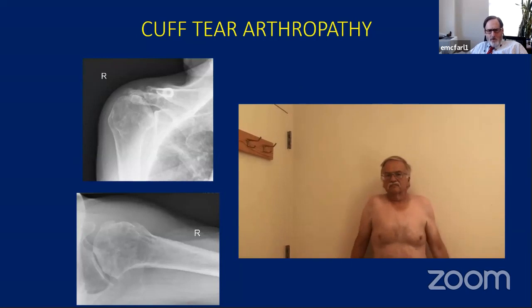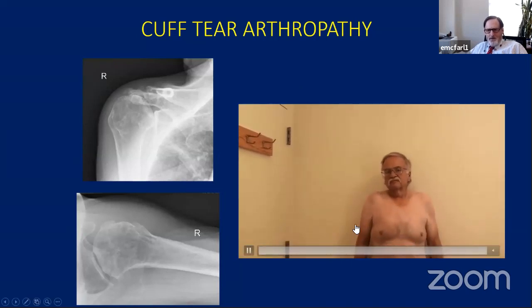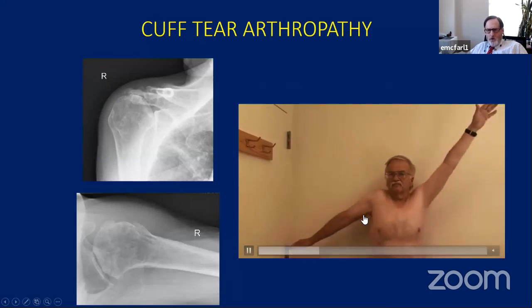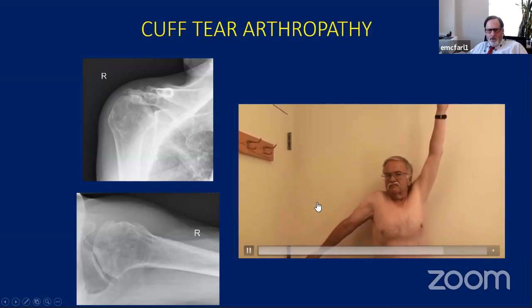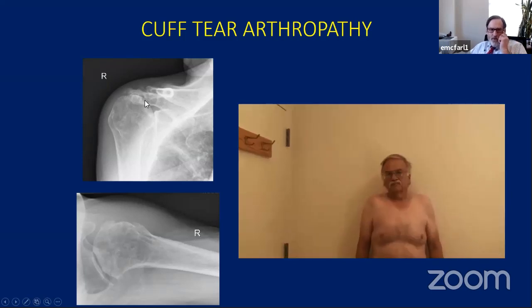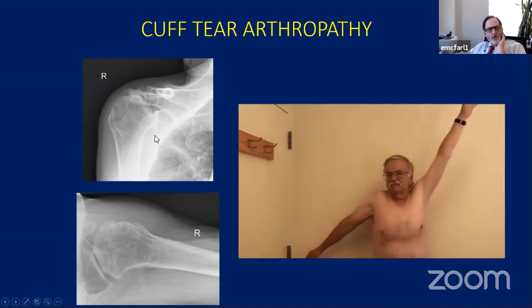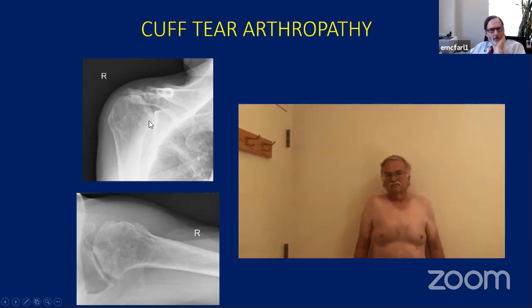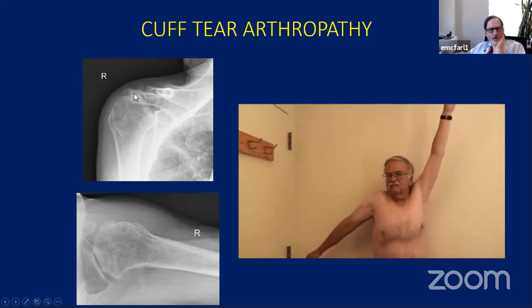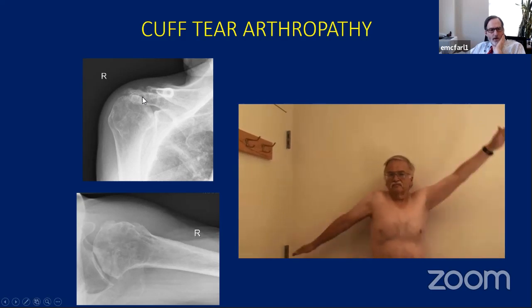This is a guy with cuff tear arthropathy. And again, he's got this classic superior subluxation look, you know, his arm only goes that far. If you have him pick his other arm up, you can get his arm up high. This is his AP radiograph here. It's a Grashey view, which I recommend to anybody doing shoulder surgery. And you can see that his glenoid is down here. The humeral head is way up there. He's got some collapse of his humeral head. His acromion has really gotten a little thin, which makes you kind of nervous.